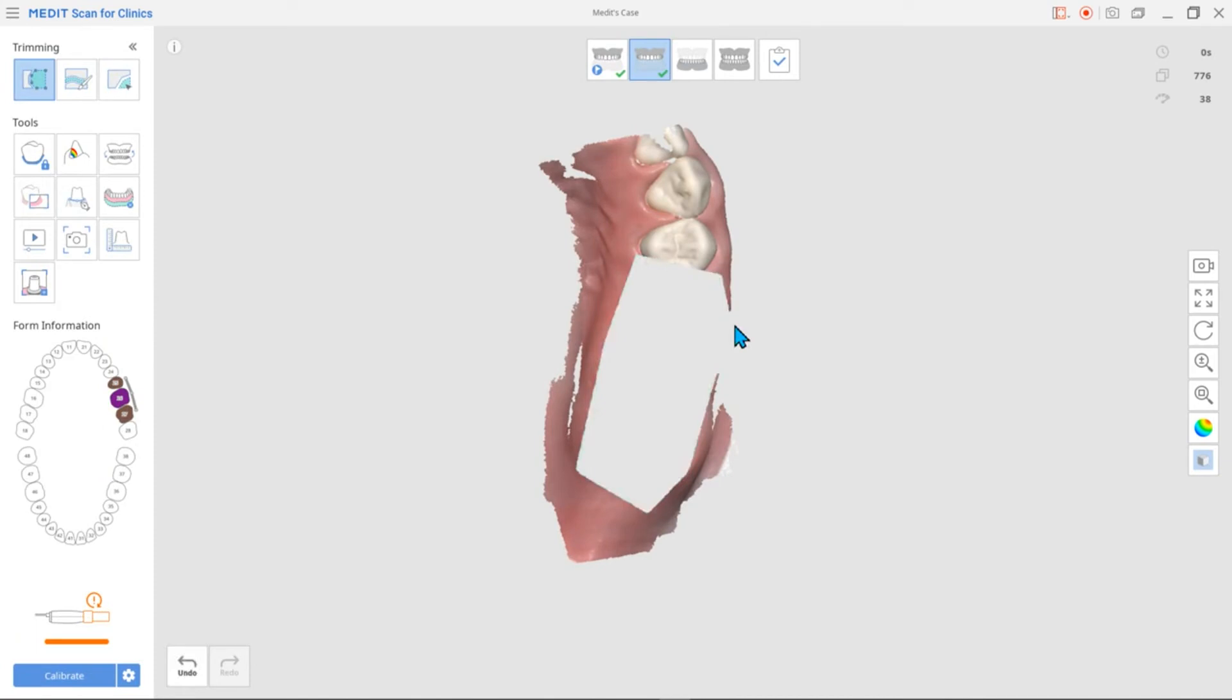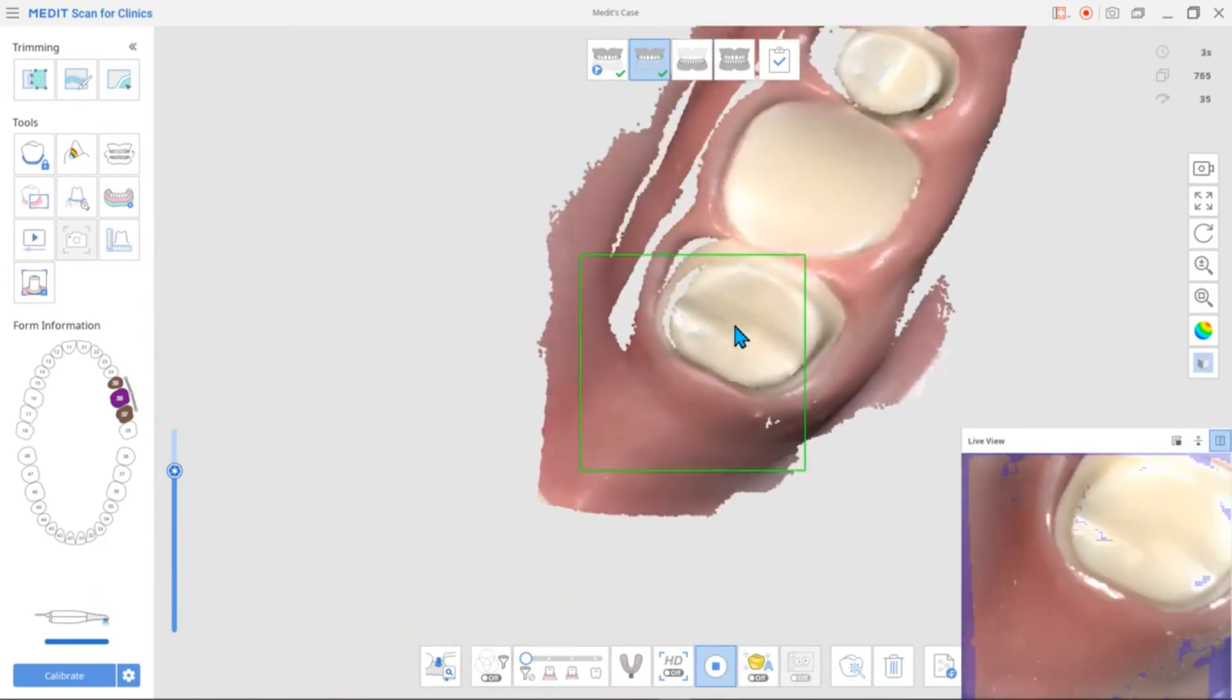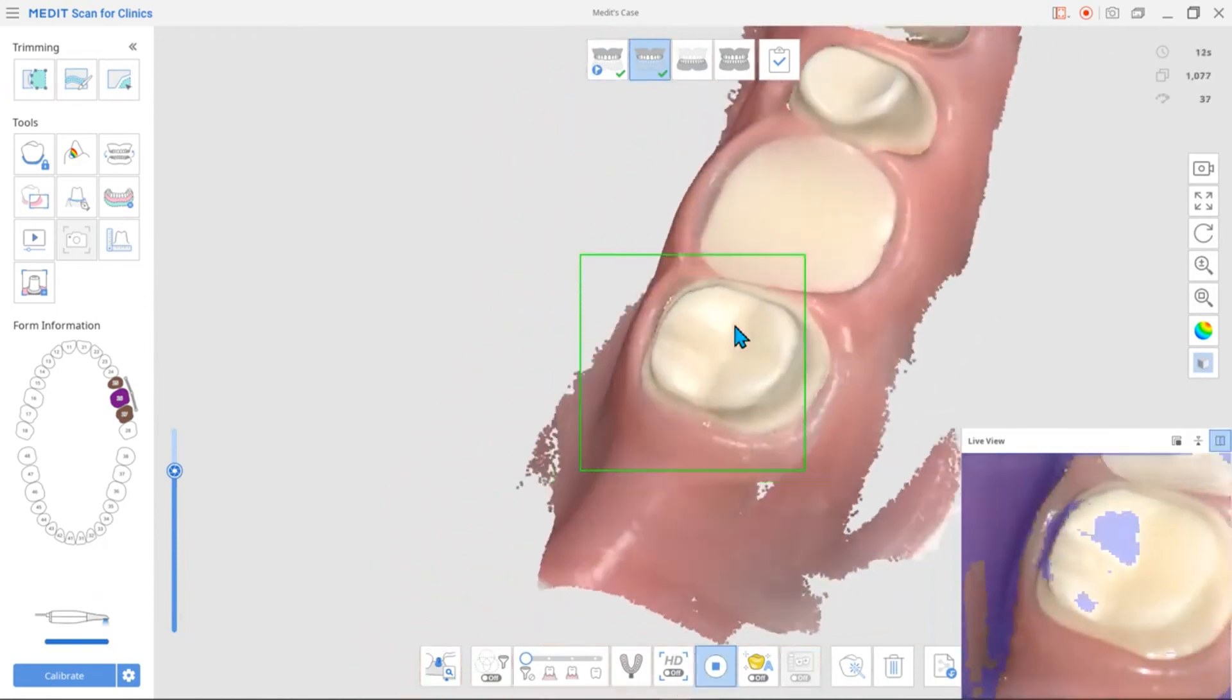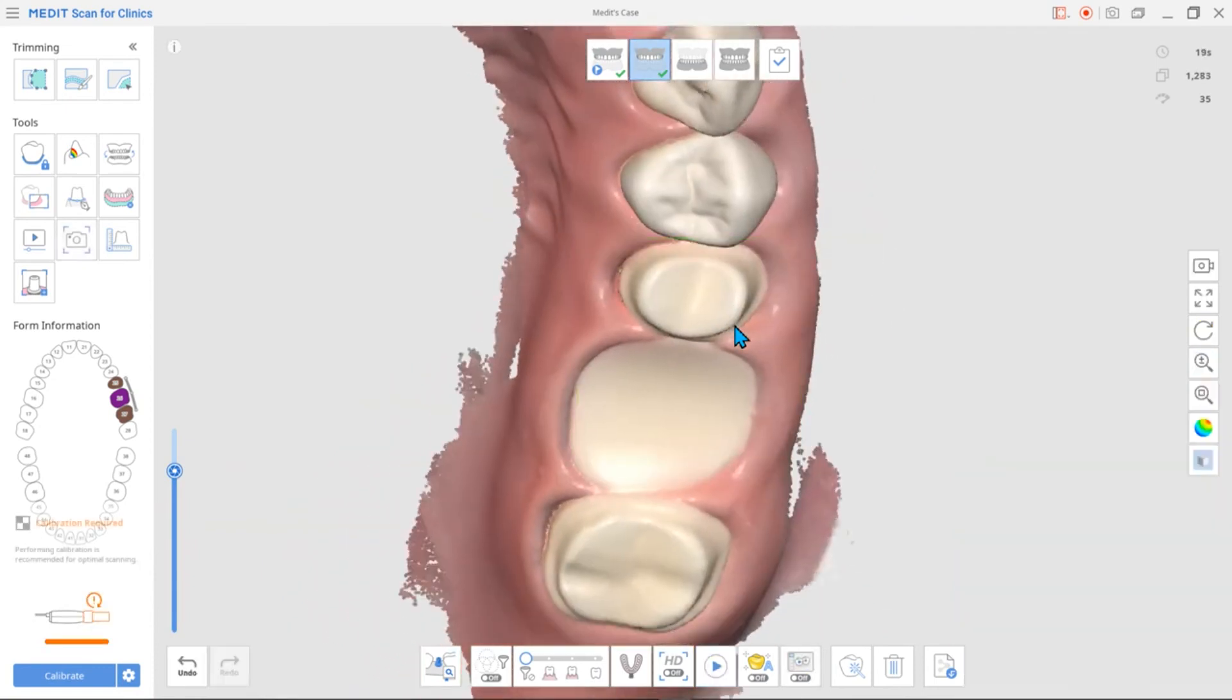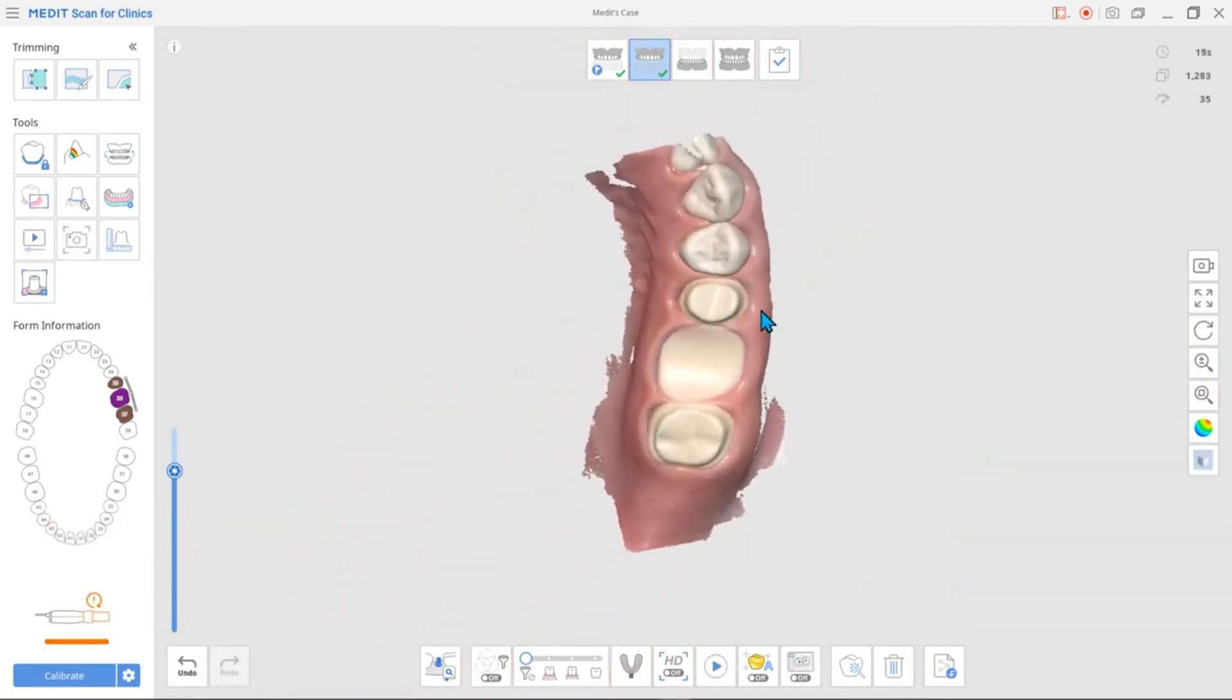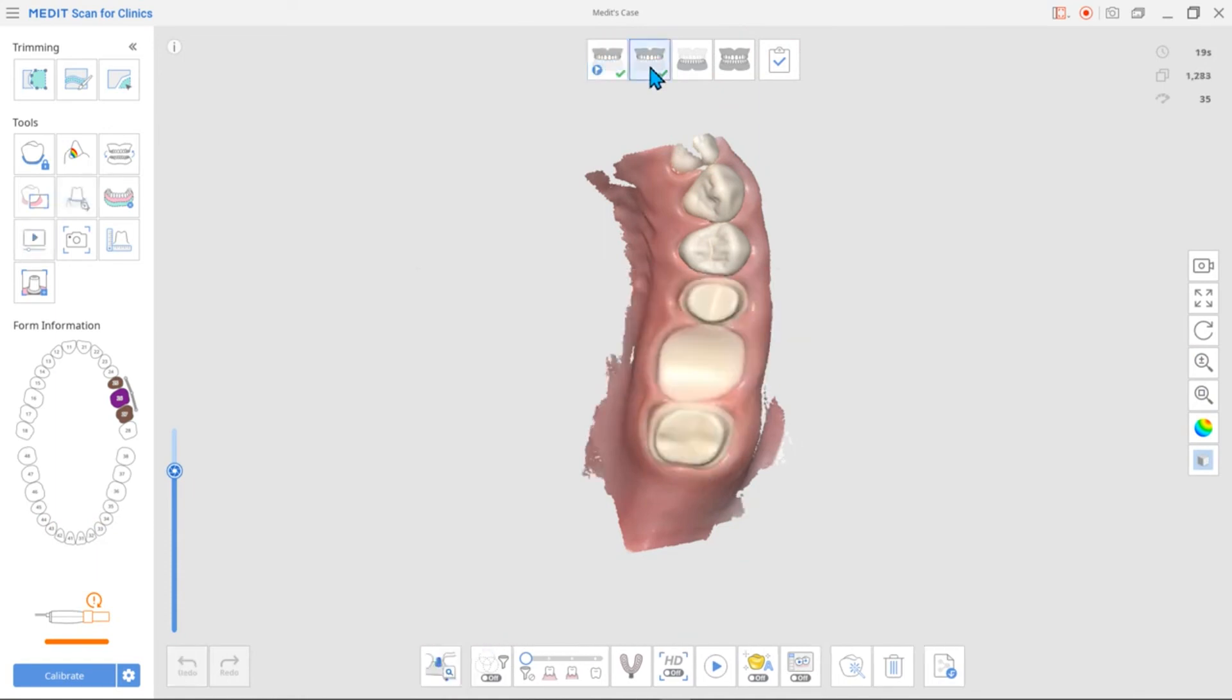The lab would then be able to refer to the prep scan when designing the restoration. You'll be able to compare the before and after data of the same tooth.